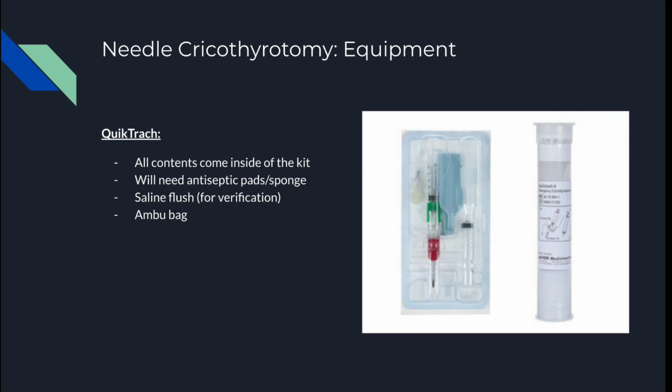One syringe for saline, and then the other syringe is for your inflation cuff. I would probably just toss the empty syringe in there that you're supposed to fill with saline, because that would require you to access a bag and pull some saline out. So just take a flush and replace it with the empty syringe that's in there.